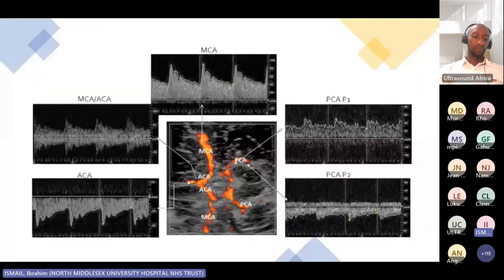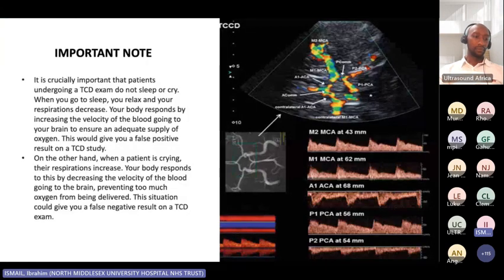Let's have a look at the imaging approach. You can see here, you will know the differentiation as basic physiology and anatomy. You will know which area is where exactly. That's it.